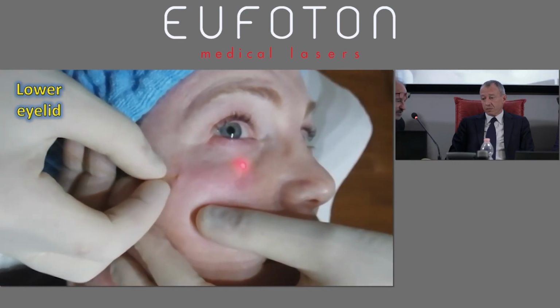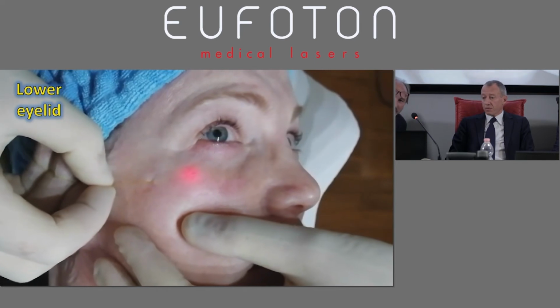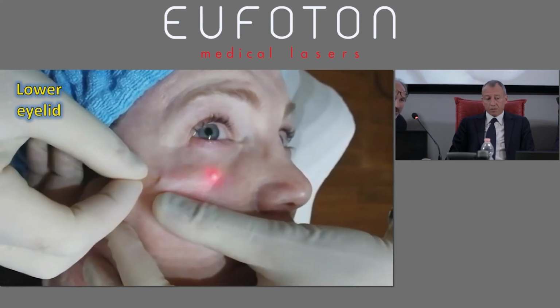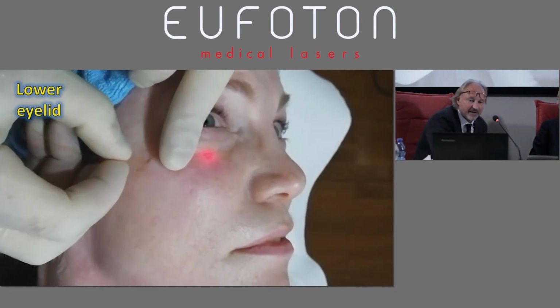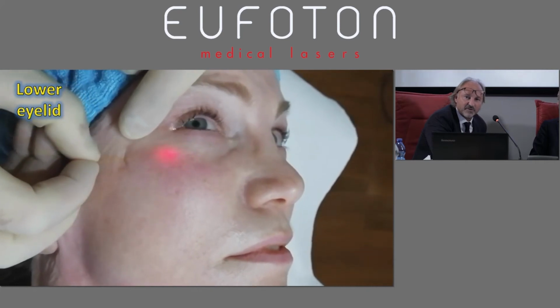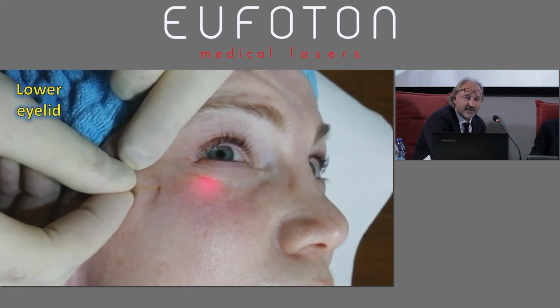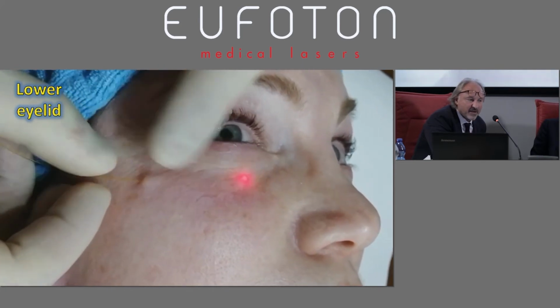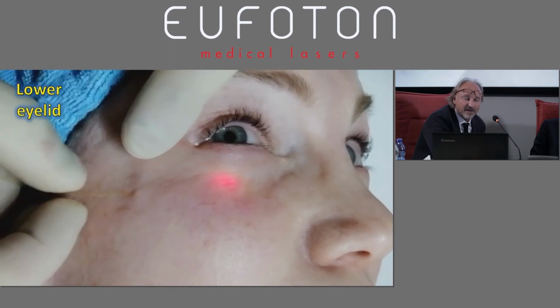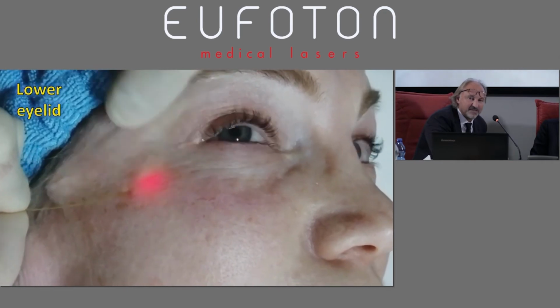Starting from the condition that what I try to do is a stimulation with no lipolytic effect. It's not a treatment for fat bags. It's a treatment improving the tissue. By nature, it's a method stimulating a sort of regeneration. It's a waste of time to hit too much, and edema is less important than I thought it used to be.